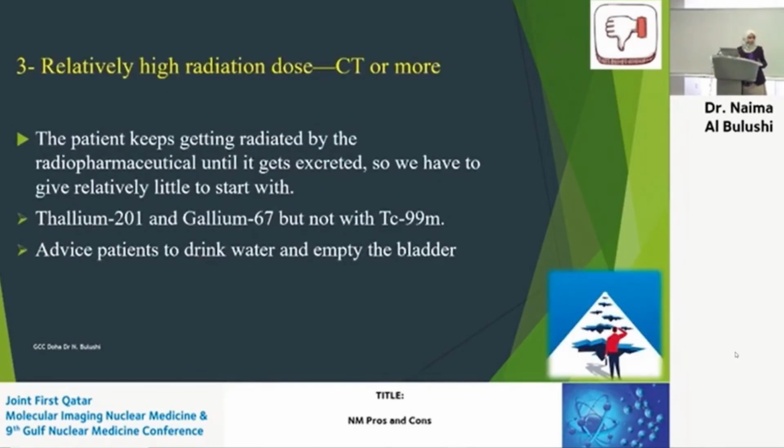Radiation dose. And I'm not the expert and I'm not the qualified person to talk about radiation dose. I think it's a room full of physicists, so they will be talking about radiation dose. But yes, we had radiation doses higher. This one started with thallium, with gallium. We do have some radiation doses higher when it goes to radionuclide therapy. But I think we managed also to have less radiation when it comes to using technetium.